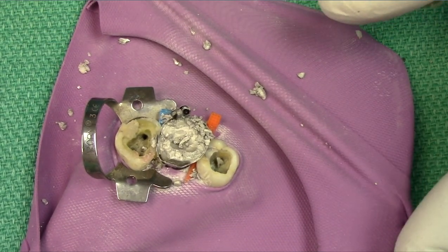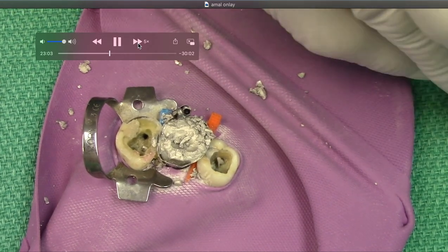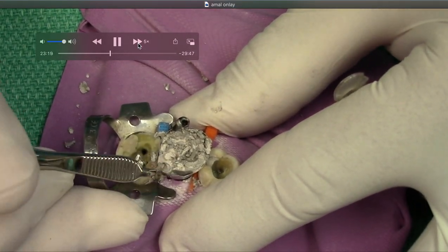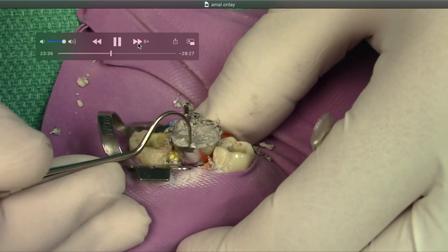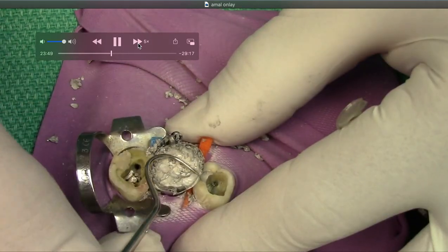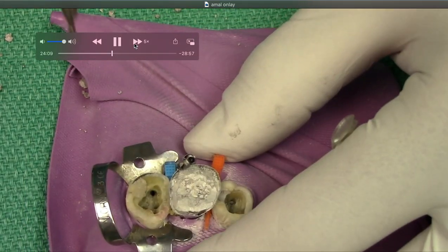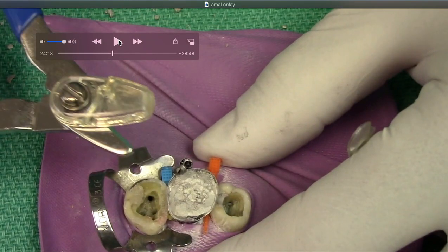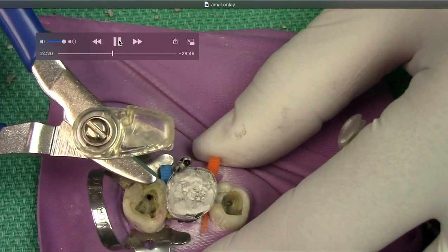We're going to place some more amalgam right in that corner, pack it in, and then continue down our journey of making this look like a silver tooth. Using the explorer to even things out, giving it some time. Now it's been some time, so we take these cutters and clip that band.